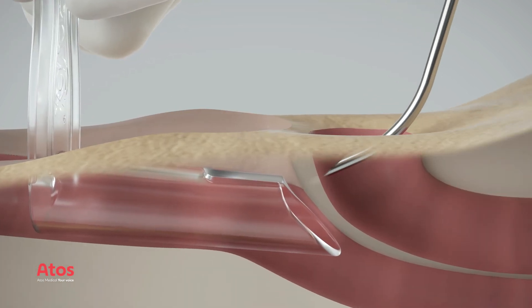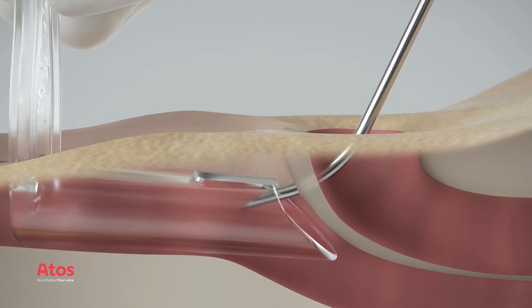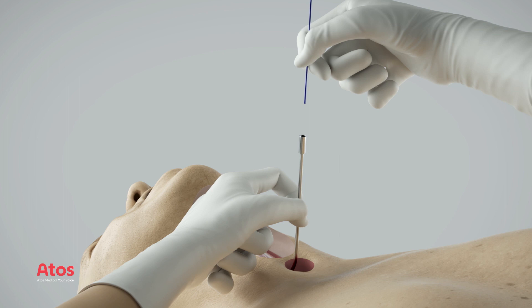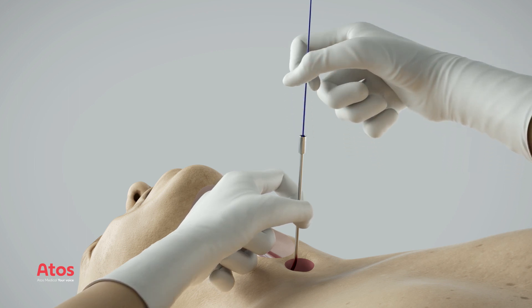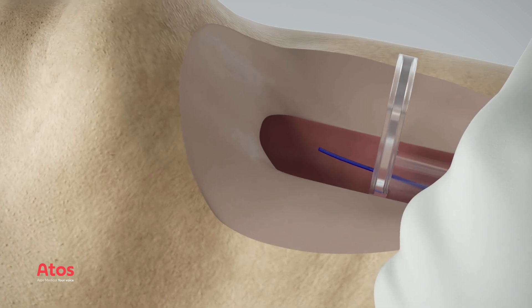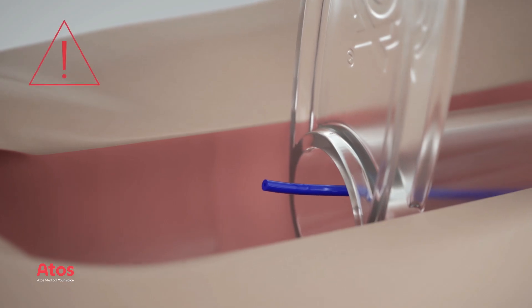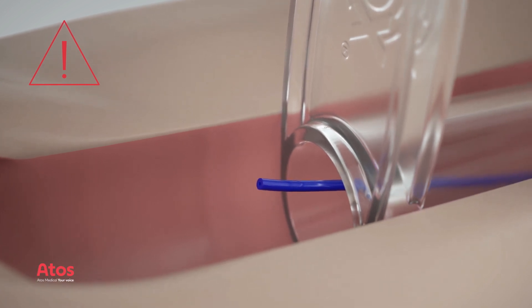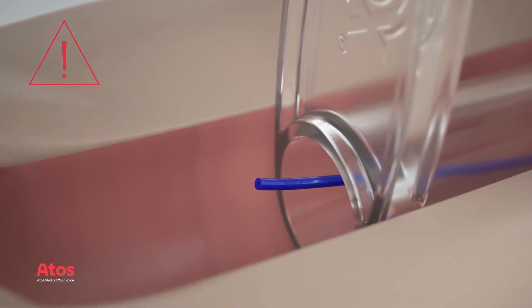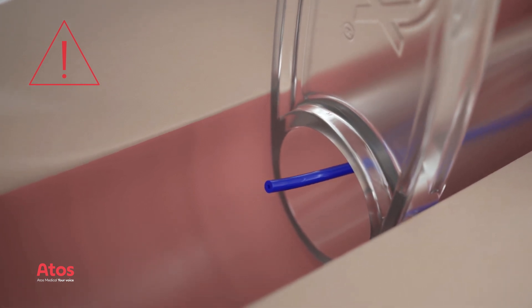Insert the puncture needle at the correct puncture site until the tip of the needle reaches the inner lumen of the pharynx protector. Push the guide wire into the needle until it extends approximately 20 centimeters out of the pharynx protector. Always verify that the guide wire comes out through the lumen of the pharynx protector, otherwise there is a risk for mucosal damage and the procedure needs to be restarted.